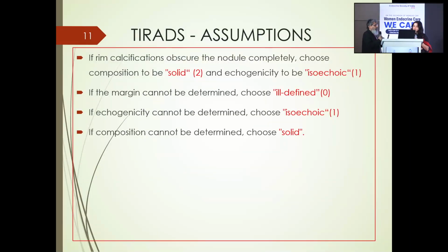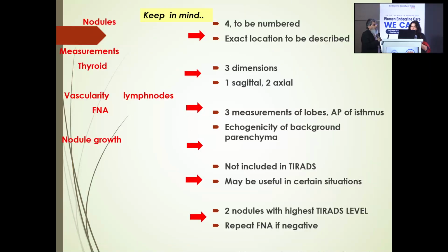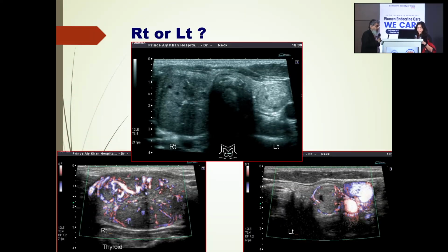So this I think we can skip that. Yeah. And this we can skip. Yeah. We'll go ahead. So yeah, we'll go with this. Yeah, and you can just tell us.